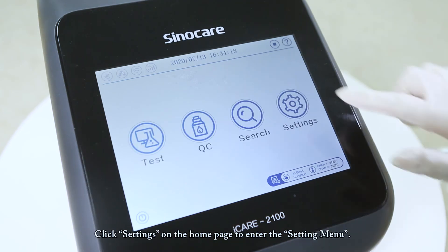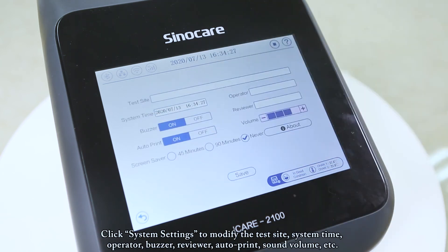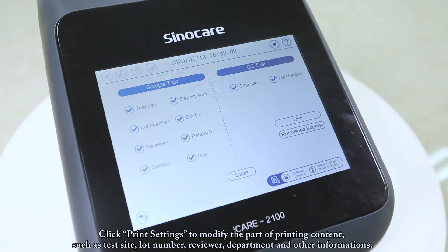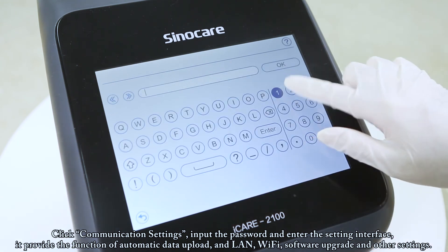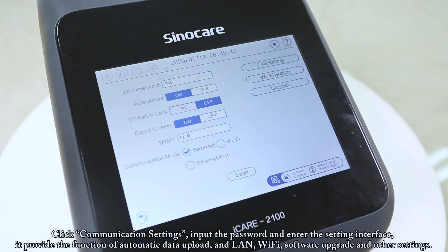Click Settings on the home page to enter the settings menu. Click System Settings to modify the test site, system time, operator, buzzer, reviewer, auto print, sound volume, and more. Click Print Settings to modify printing content such as test site, lot number, reviewer, and department. Click Communication Settings, input the password, and enter the interface which provides automatic data upload, LAN, Wi-Fi, software upgrade, and other settings.